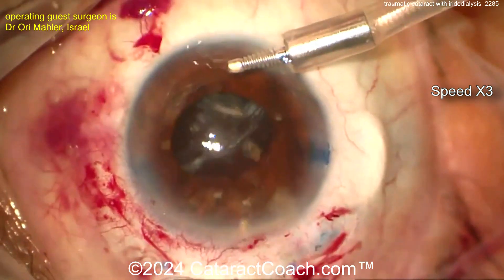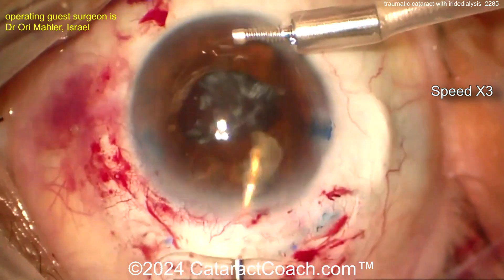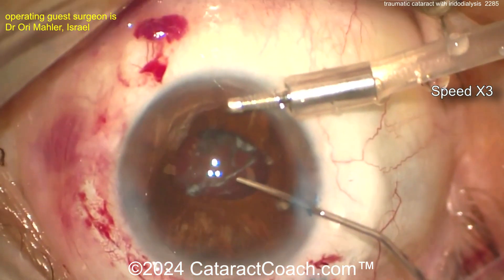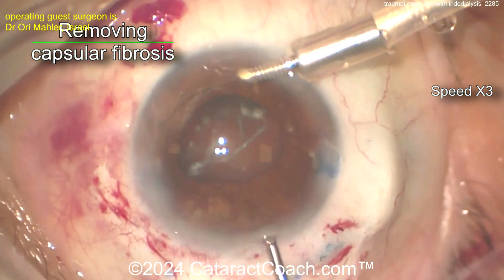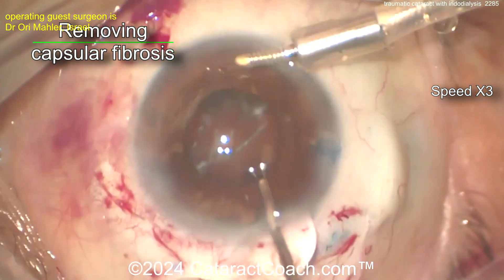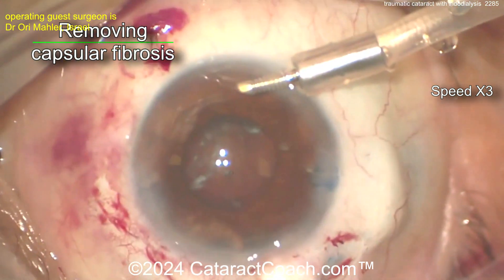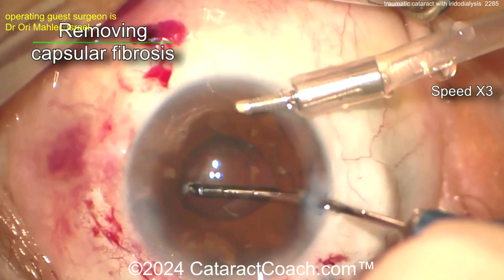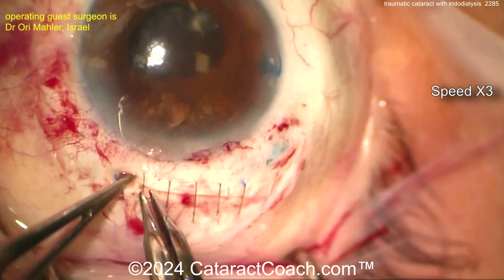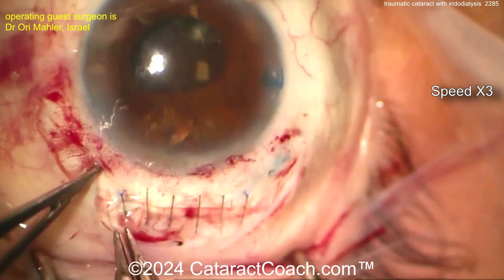Now clean this up, maybe wash out the rest of that lens material — perhaps a little bit of bimanual I/A. Let's see what's going on in the bag. Yeah, more fibrosis of this capsule. Trauma cases are tough; you just kind of never know what you end up with. And patients sometimes don't get the concept that you cannot undo trauma.